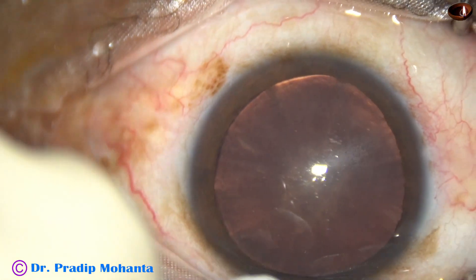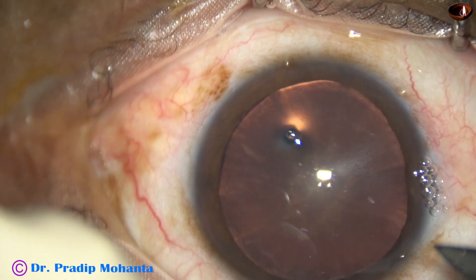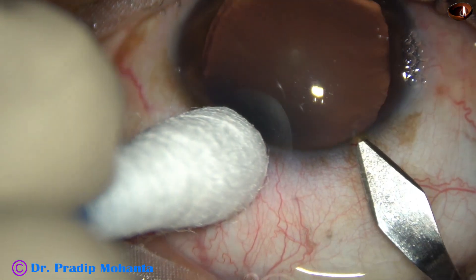This is a soft cataract. There is posterior subcapsular opacity. The patient is diabetic for 12 years. Though soft, this kind of cataract is not easy to manage.